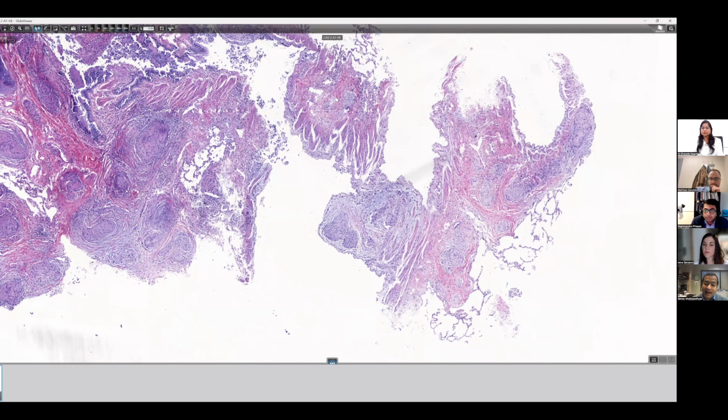Yes, and if it's a small biopsy, if the clinical setting is, if they're suspecting sarcoidosis, that also helps me to say consistent with sarcoidosis in the line diagnosis. So I put that line when everything is correlating in my cryobiopsies as well, because we even get very good, big cryobiopsies where, in case of sarcoid, I could find the lymphangitic distribution. When everything is correlating clinically as well as radiologically, I go ahead and put the line non-necrotizing granulomatous inflammation consistent with sarcoid, and again correlate. That's what I put the line as.